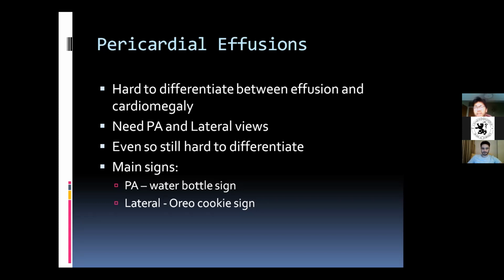I know that the main pathologies will still revolve around the lungs, but that is why F is at the very end. It's because you need to go through all these before you identify any pathologies in F.